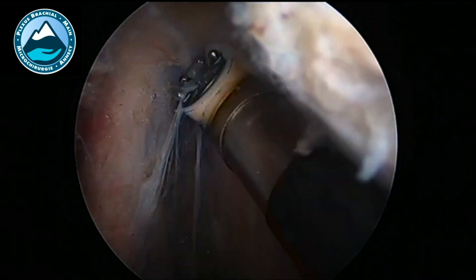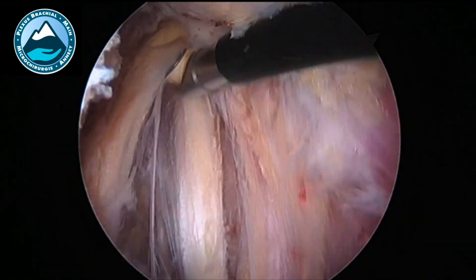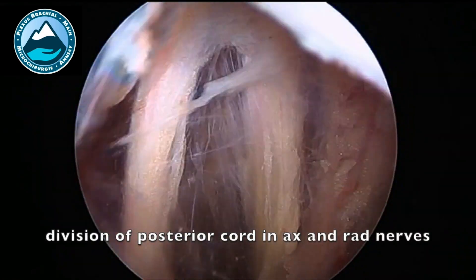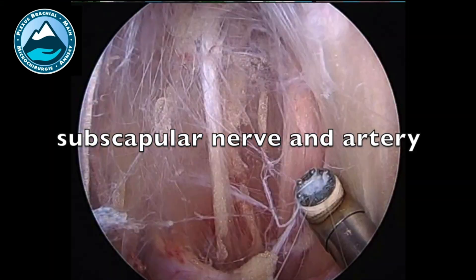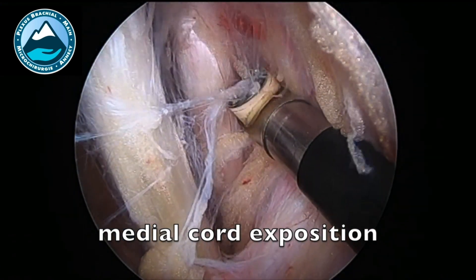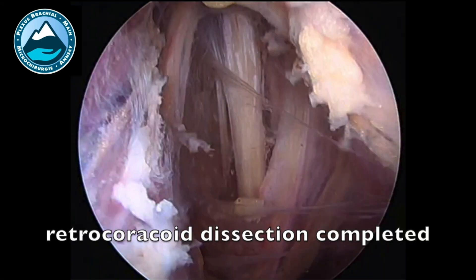The axillary nerve is really close to the subscap. It's the most posterior nerve from this view, and the radial nerve is coming right anterior to that. You can dissect until the division of the posterior cord into axillary and radial nerve. Then you can dissect the subscapular nerves and artery — the subscapular artery must be the inferior limit of the dissection. Then medially you will see the medial cord and can expose and start the dissection there.